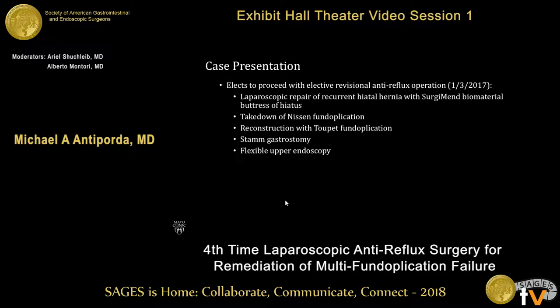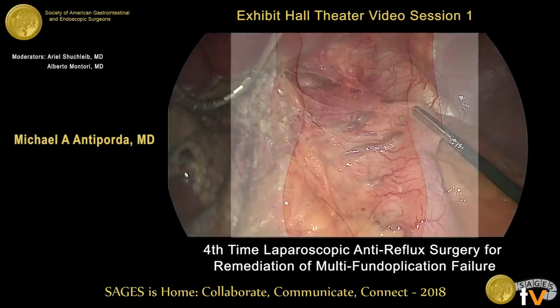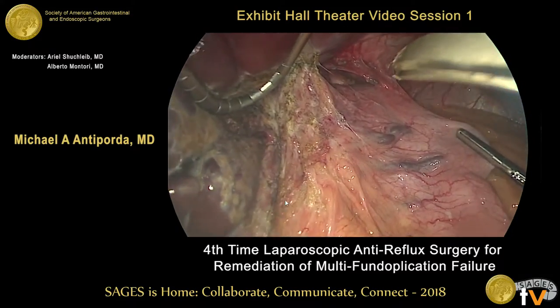With these studies, we recommended a revisional operation to repair his recurrent hiatal hernia, take down his prior Nissen, convert it to a Toupet, and perform a STAMM gastrostomy. Ports are placed as shown, centering around the left mid-epigastrium.